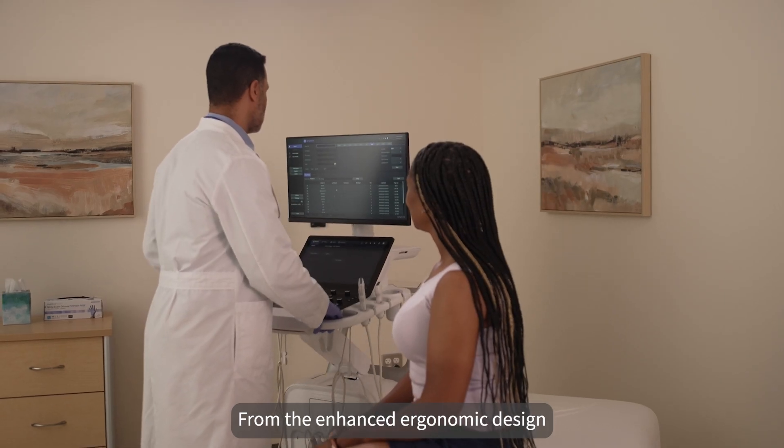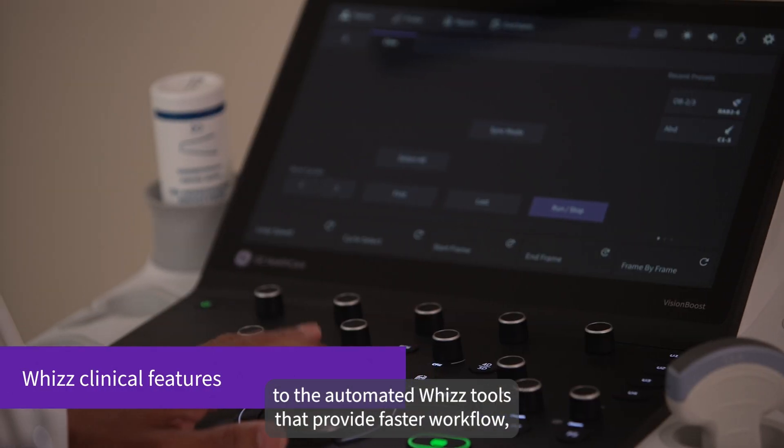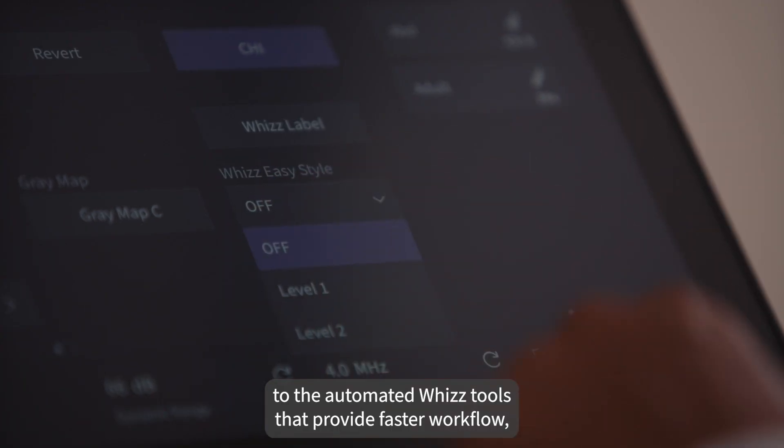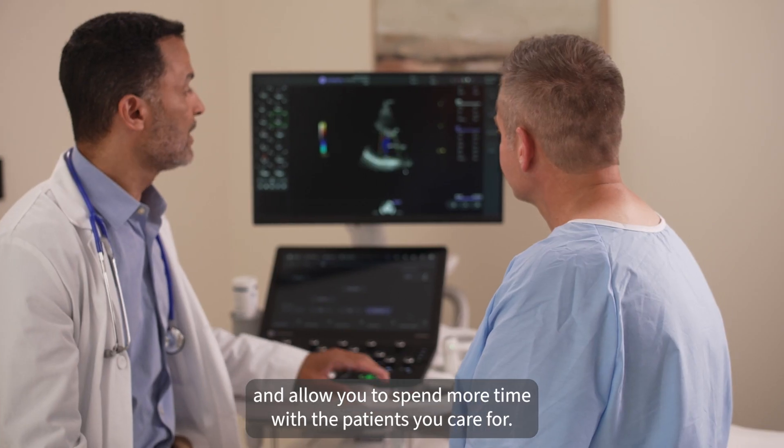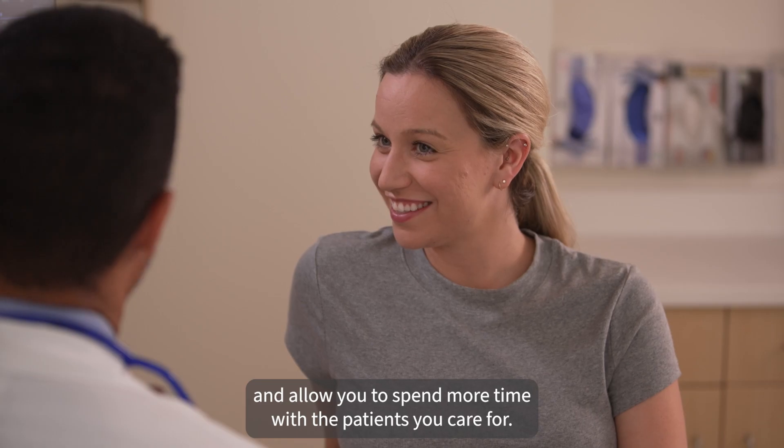From the enhanced ergonomic design to the automated wiz tools that provide faster workflow, each detail is designed to fit seamlessly into your daily routine and allow you to spend more time with the patients you care for.